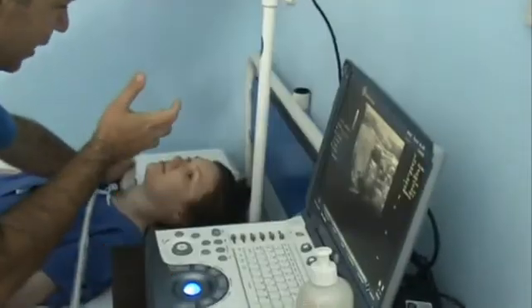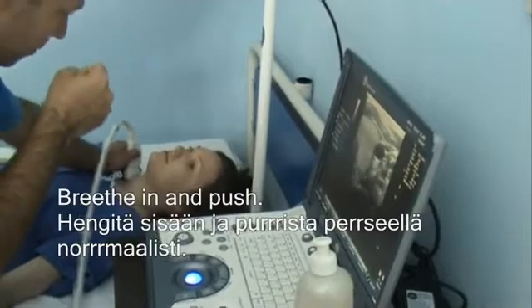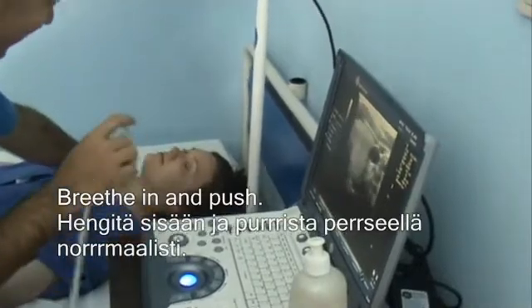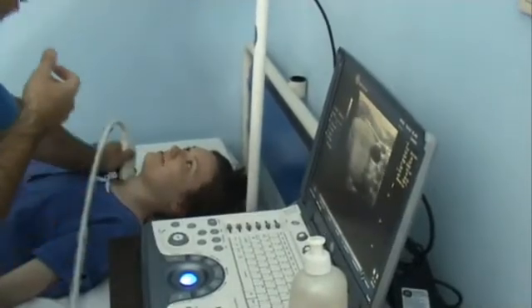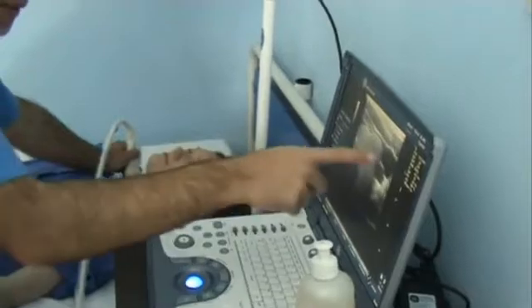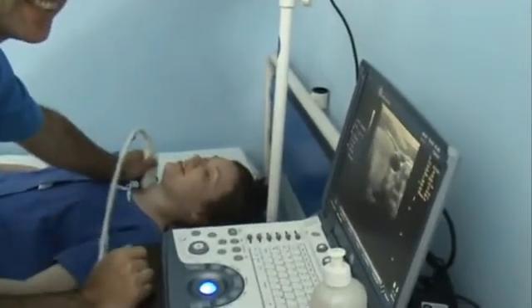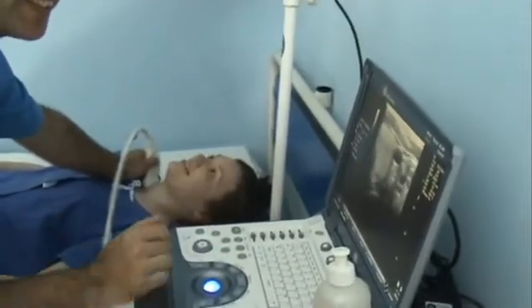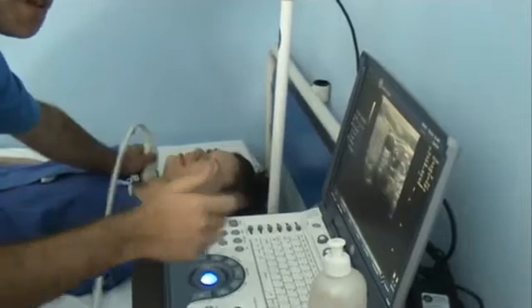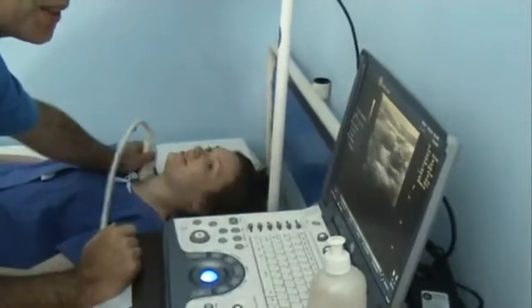Please take a breath in, hold and push. You see? With normal. So the vein is, actually, it's big. But it's not active. There's no flow here.